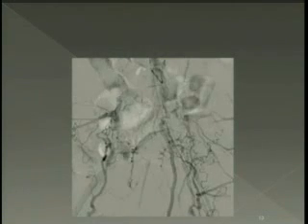I think what I would have done is leave this wire which went subintimally on the left side and try with another wire from the contralateral side, so that we know where the subintimal plane is and we go into a different plane in a different view. Normally I would do the same and cross CTOs first through a femoral or brachial approach, because it gives you much better pushability if you can get to a true track, and you can manage better. Michel, what do you think?